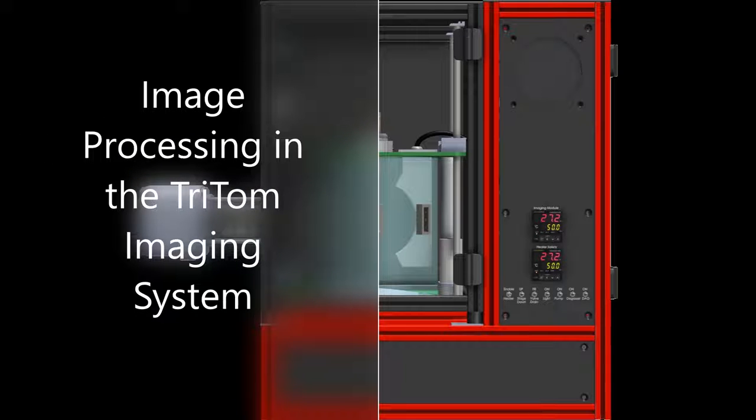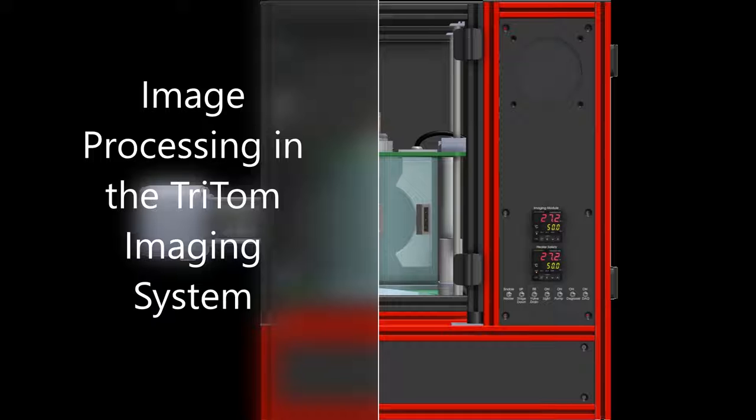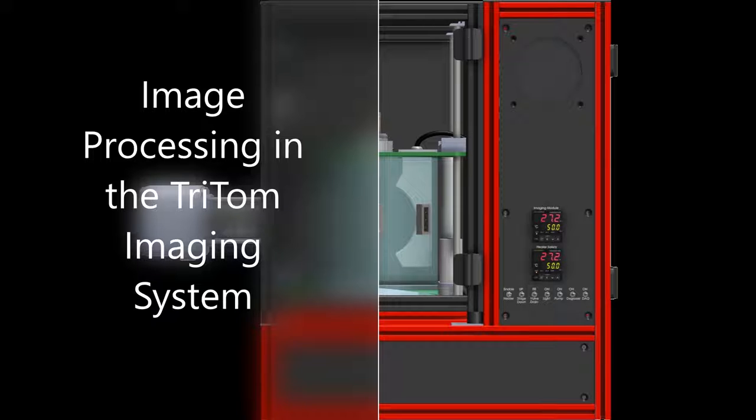This video demonstrates how to operate the TriTom imaging software for an in vivo imaging experiment using the TriTom Small Animal Imaging Platform from PhotoSound Technologies.